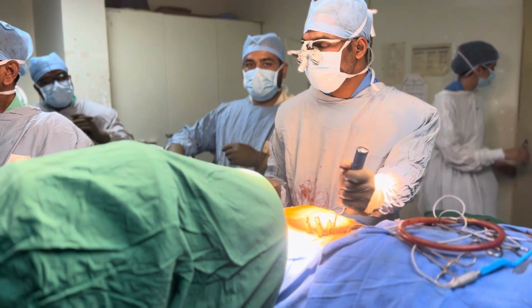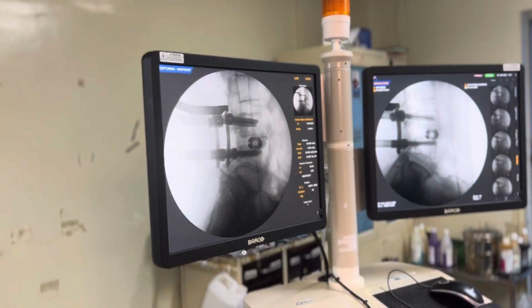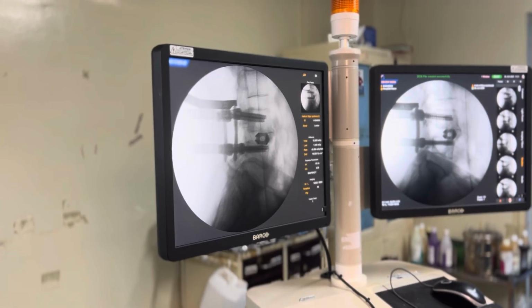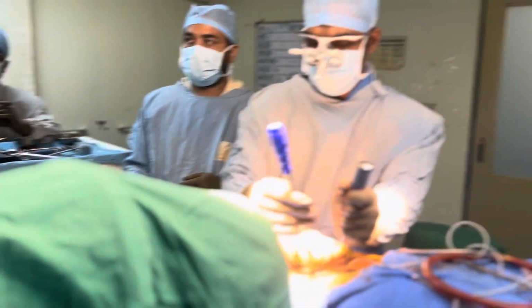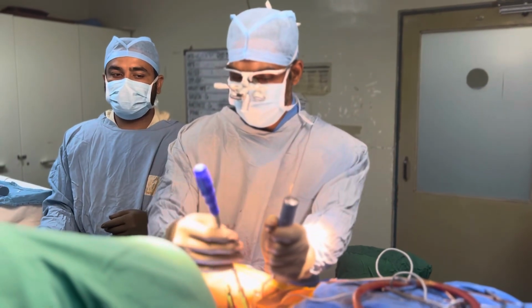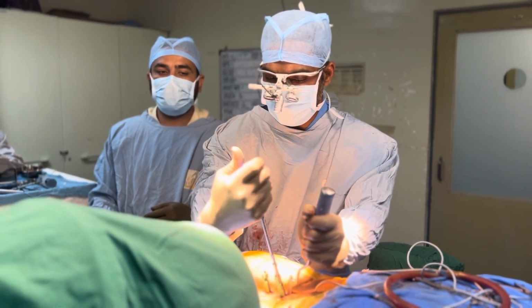Now shoot. Now we can see the two rods in this image, one which is already fixed and the other one which we are fixing now. So by doing this you will be able to see the two rods and confirm the length.